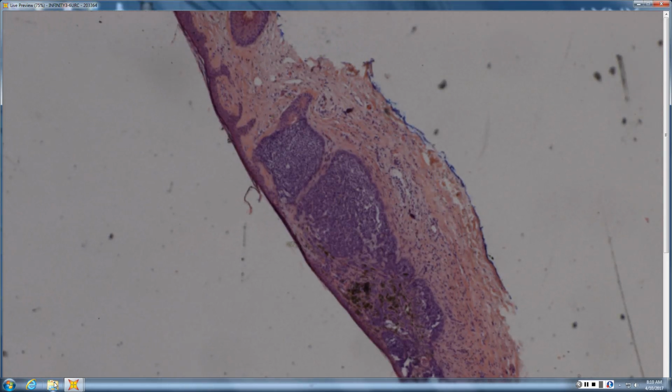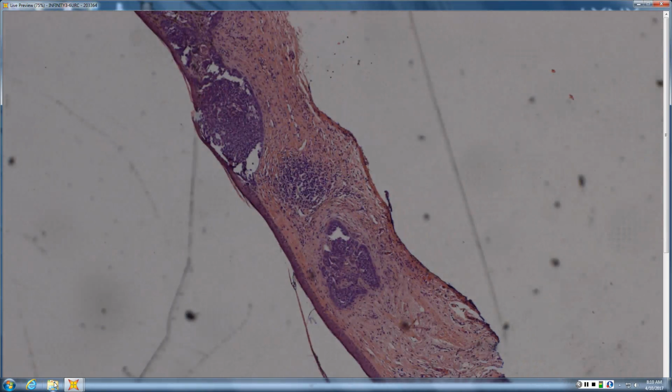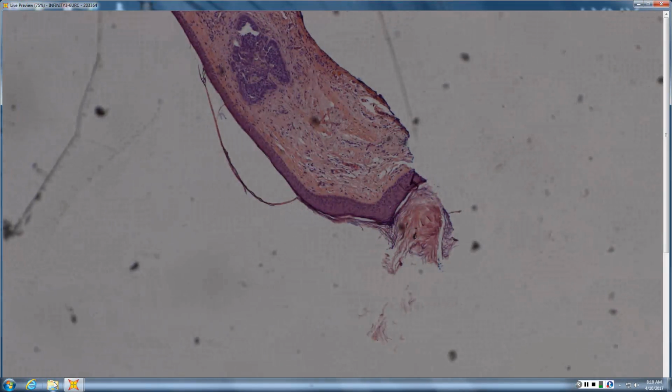Thin little shape. First glance, just a little blue basal. It looks like a little basal cell. So tell me about the margins. Looks like the stroma is going to the margin. Yeah, exactly. So you don't have to see tumor at margin. Stroma at margin counts. So normal papillary dermis would end about where the tip of the arrow is, and everything below it would be bundled collagen. This is all tumor stroma, all the way down. And that's going to an edge, so that counts as positive.